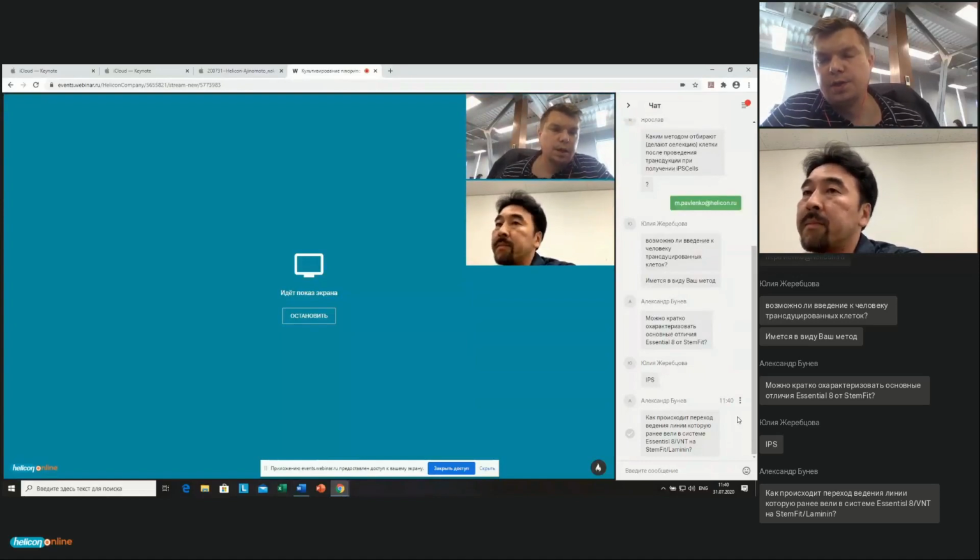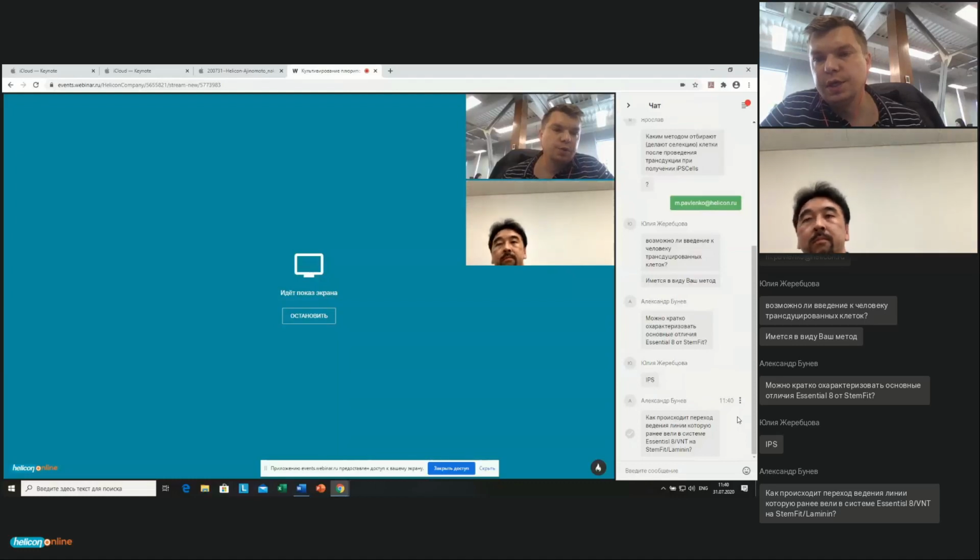Да, коллеги, если я опять же уловил ответ доктора Накагавы, в его экспериментах по сравнению среды Essential 8 и StemFit было показано, что морфология клеток и рост клеток лучше происходит на среде StemFit.